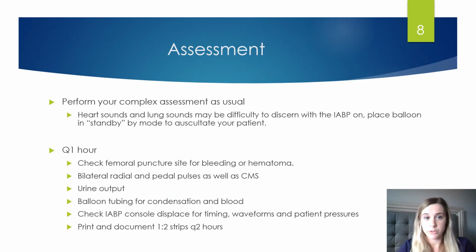So, first thing we want to do is perform a complex assessment of this patient. We're going to listen to her heart sounds. We're going to listen to her lung sounds, especially if she was having any kind of pulmonary edema. We want to be able to clearly auscultate what's going on. So the best thing that you can do is place the balloon pump in standby mode to clearly be able to auscultate heart sounds, lung sounds.